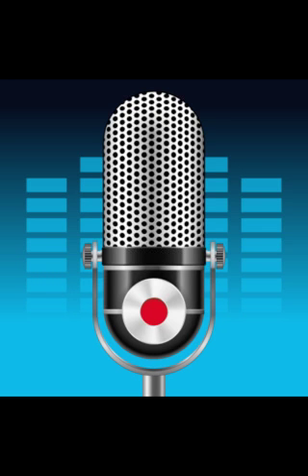Send. Message. Text field is editing. Hello, I'm just testing something for this audio demonstration. Character mode. Insertion point. I'm just going to make a few mistakes here and there. Misspelled. Okay, now I'm going to show you how I edit stuff.